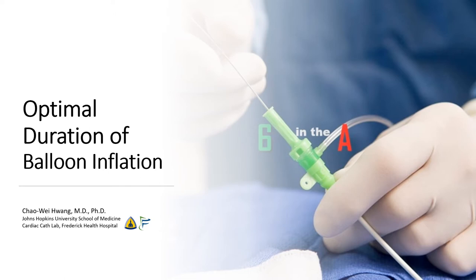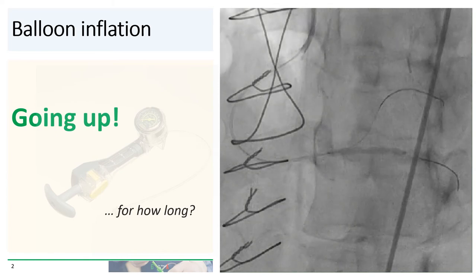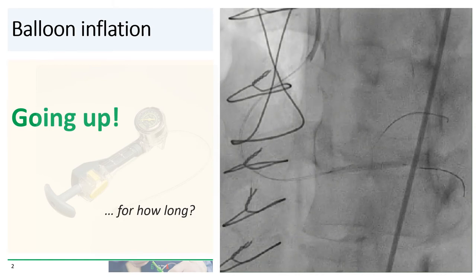Today we're going to talk about optimal duration of balloon inflation. "Going up?" For all of us who work in the cath lab, this is a phrase that we use nearly every day. But the question is, how long should we actually keep the balloon up when we're deploying a stent?